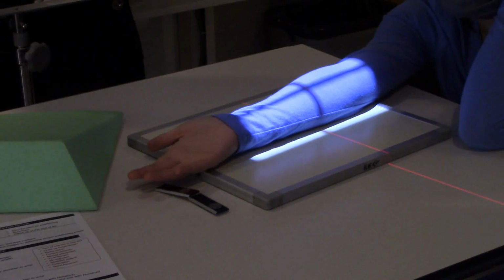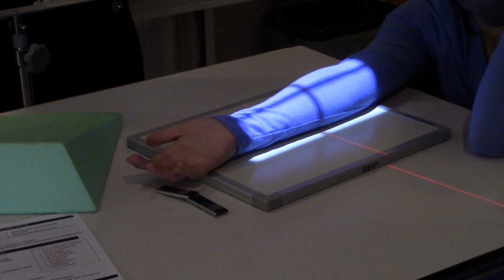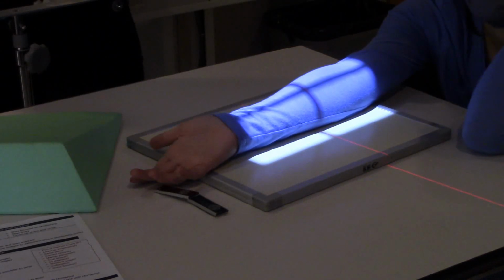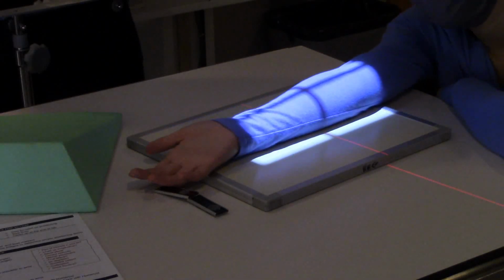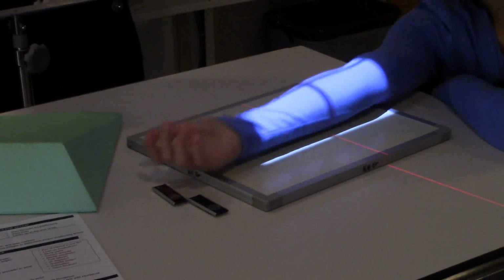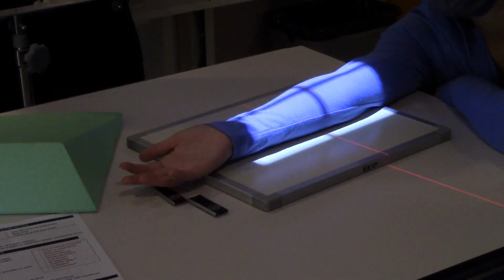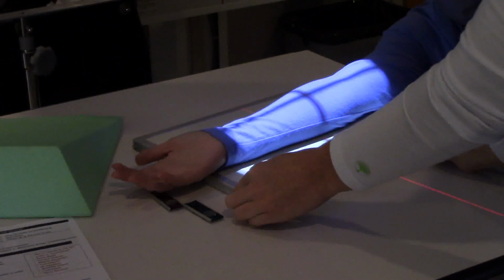Okay, where are we going to be aiming for this x-ray? I don't remember. Well, in that case, let me jog your memory. The midpoint of the forearm, mid-shaft of the forearm, is where the central ray is going to go. And we want to make sure we include all the wrist and all the elbow. So can we get all the wrist and elbow on this 10 by 12 image receptor? Why, yes, we can.